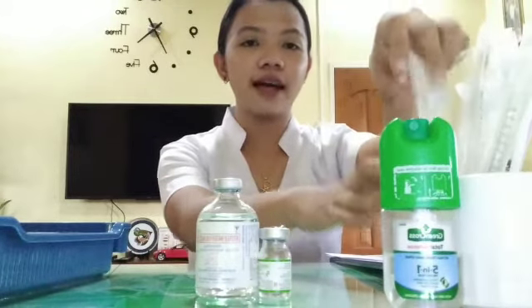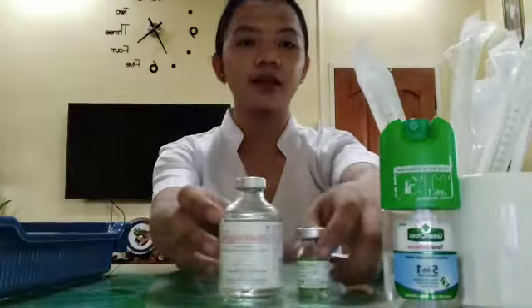So after that, we will follow the 5 rights, which is the right drug, the right patient, the right dose, the right time, and the right route for administration. So the next thing that we will do is we will pick up 1 tuberculin syringe and 1 aspirating needle.